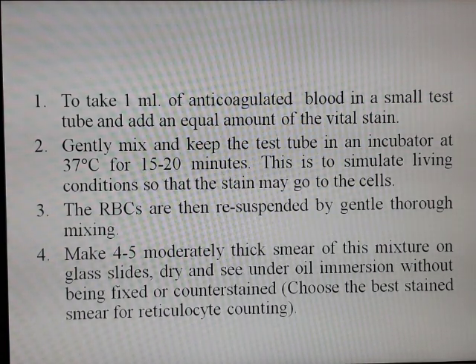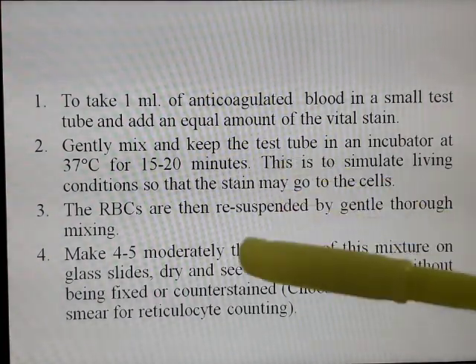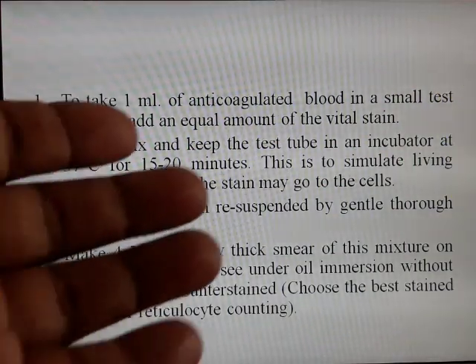Suppose we do not have an incubator. Suppose this pen is a test tube with the blood inside. In the palm of the hand we can keep the test tube like this, in a horizontal way, and then do rotating motions also, for like 15 to 20 minutes.